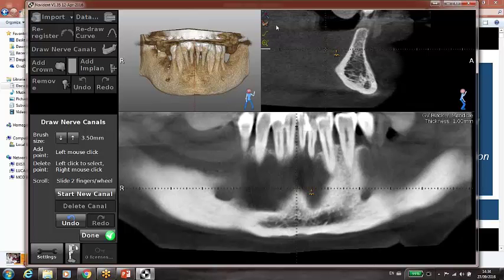You can do the same on the left. You see the icons on the left, on the right quadrant, top right. There's a magnifying lens, S shape, and you see the same information also on the bottom quadrant, with the exception of a toggle, where you can add or hide text. If I toggle it, I can hide the text. If I hit it, it shows me the text.